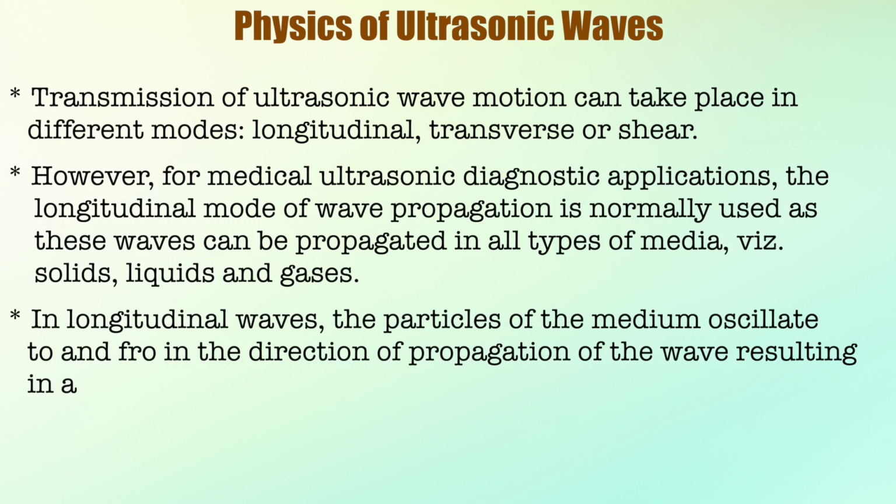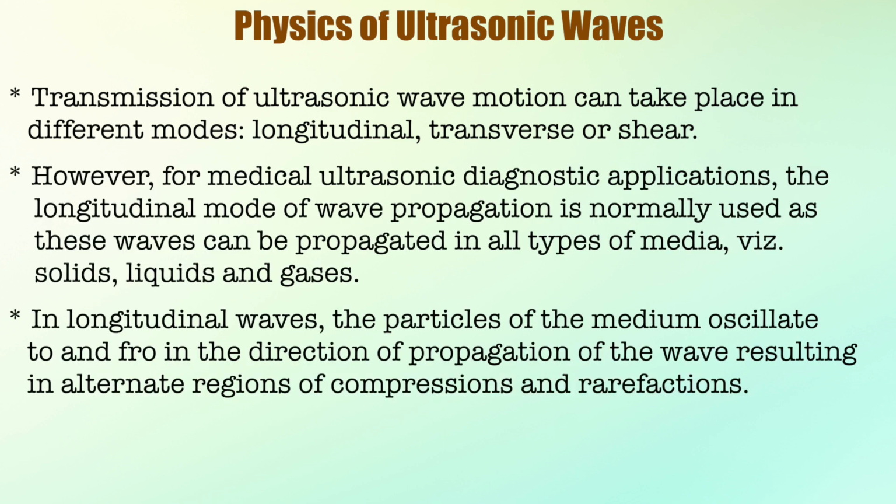Transmission of ultrasonic wave motion can take place in different modes: longitudinal, transverse or shear. However, for medical ultrasonic diagnostic applications, the longitudinal mode of wave propagation is normally used, as these waves can be propagated in all types of medium, for example solids, liquids and gases.